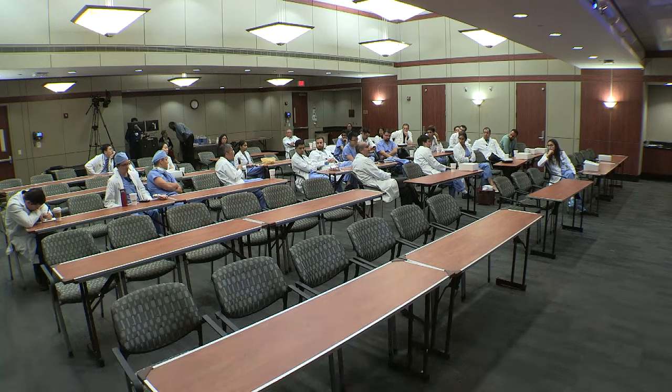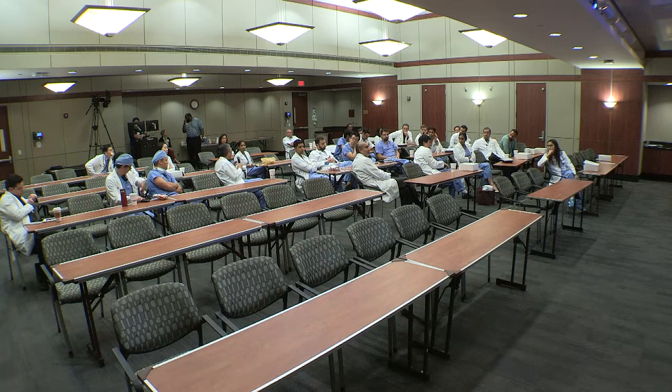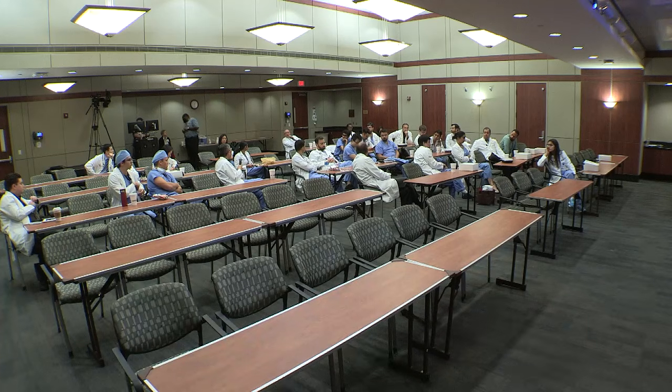We do that here with flash mode with a Siemens scanner, but I really would like to do a study, same patient, scanning with flash mode and prospective mode. So the bottom line is, there's a possibility of doing a CAT scan of the heart with the radiation dose of a chest X-ray, but we have to use very low kV imaging. I don't know if that makes sense. And that would set up a whole new set of standards to define the calcium? Correct. The calcium score that we clinically use is based on 120 kV imaging. Okay.